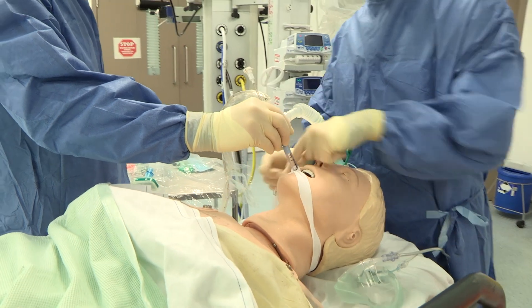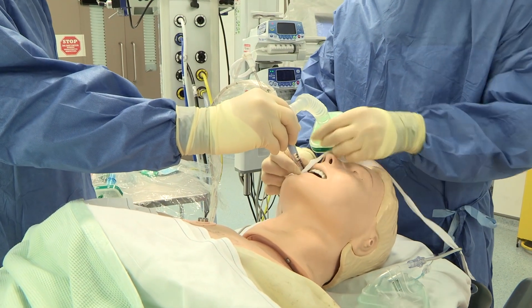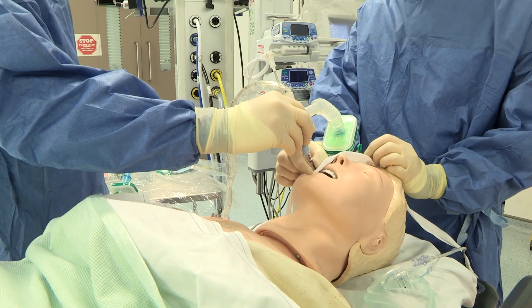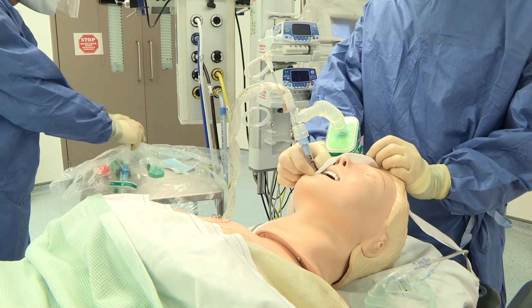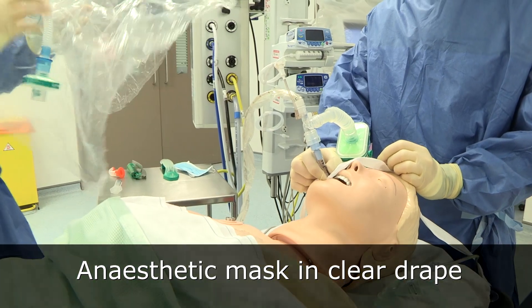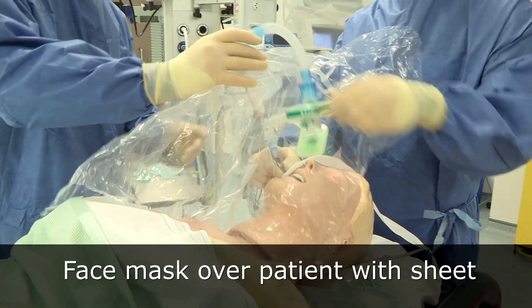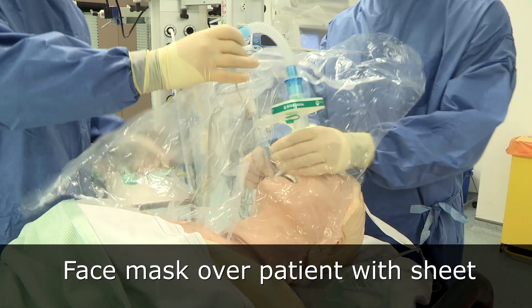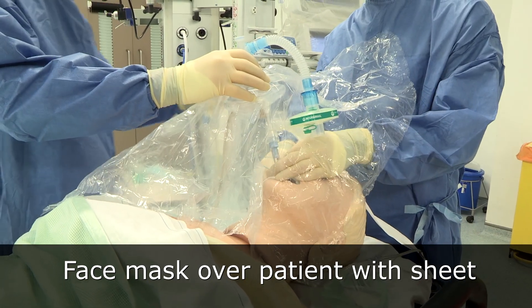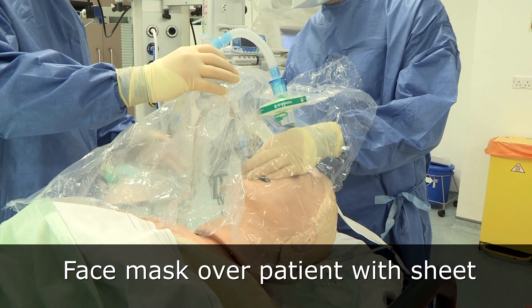Thank you very much. I've got the tube. If I could ask you to pass me the mask with a new catheter and HME filter. And then with the other hand, if you could pass me the syringe, please. Okay, so I'm deflating the cuff.